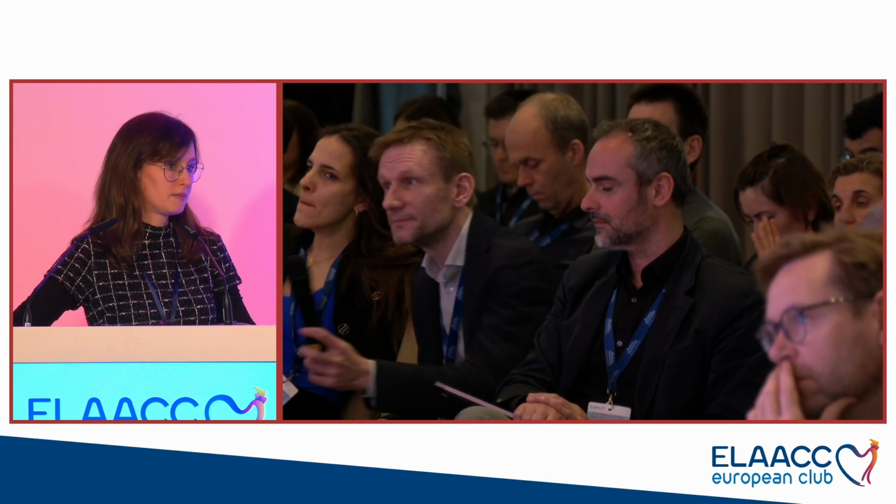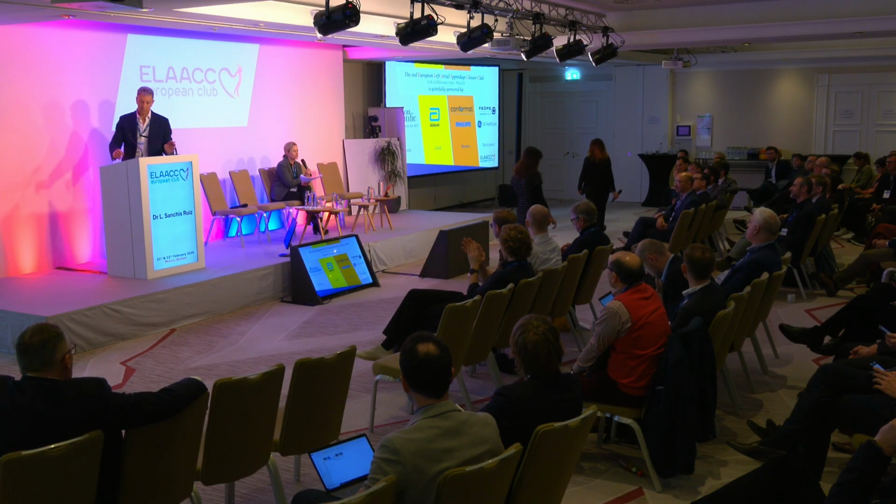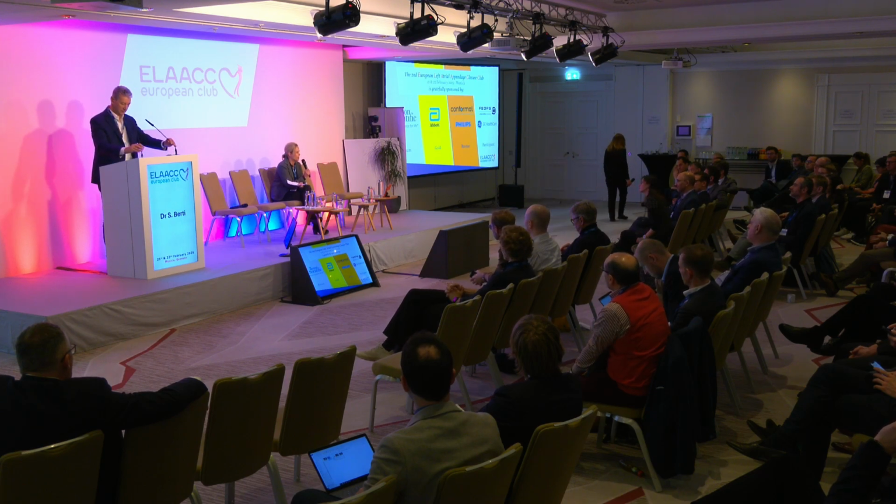Yeah, good. So thank you very much, Laura. And Sergio, while you are bringing up your slides, I have one question for the interventionalists. Laura, you showed a case of a very contractile left atrial appendage. Is this really a challenge for implanting a device, or is it just something which accounts for a higher rate of embolization? From an implantation point of view, is it more difficult for you?